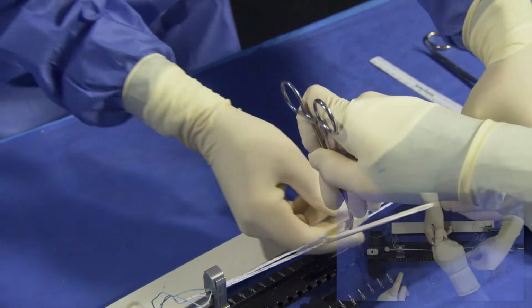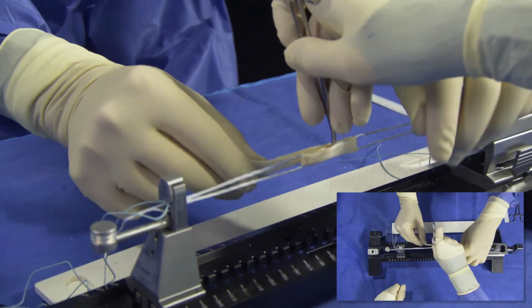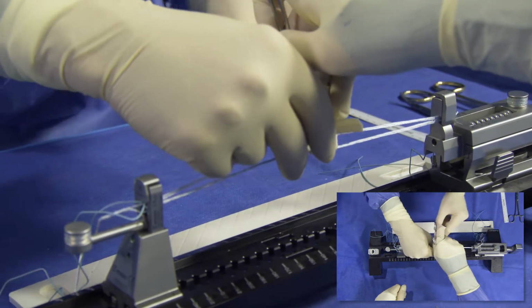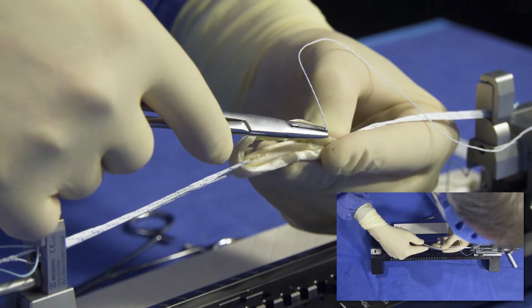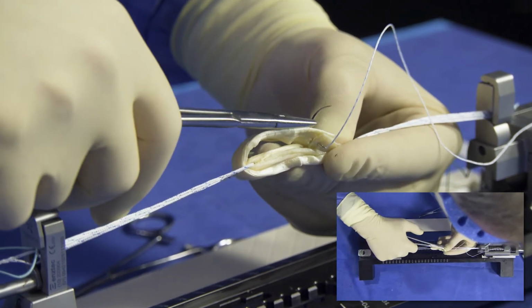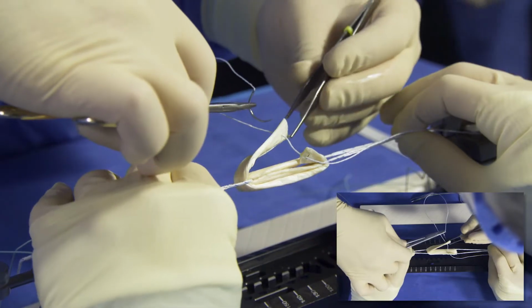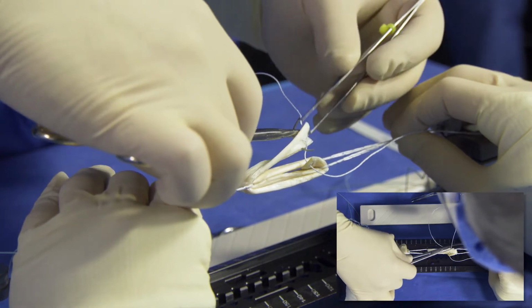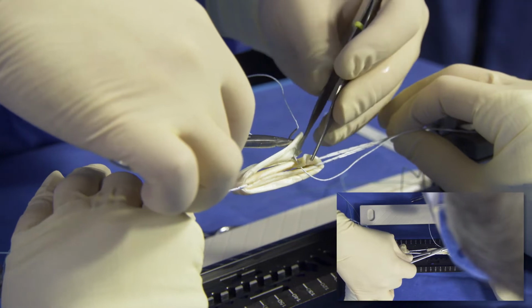In a situation where the tendon harvest length is felt to be somewhat short and standard ideal overlap of both ends of the tendon by 12 millimeters is not possible, an alternative technique is used to first sew the tendon ends to each other. The same continuous loop of tendon is created between the ultra buttons, but the tendon is then sutured end to end.